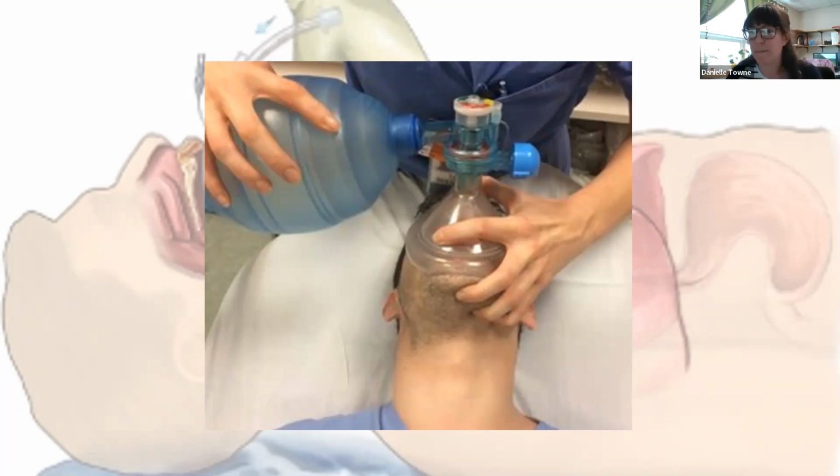You can use OPAs or NPAs to help assist you to keep that airway piece open, because let's say you're doing a jaw thrust. Well, it can be kind of hard to do a jaw thrust and do masking. So you put an OPA or an NPA in, that helps to keep your airway open. Now you can focus on your masking, that's your breathing. Now you've got the whole picture together, all right?